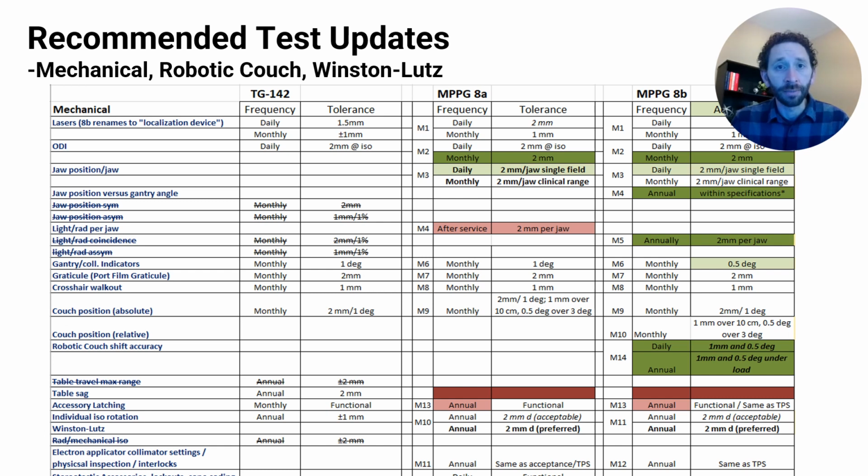Other things, light radiation, light rad testing, not necessary any longer as it was per 142. 8A put it as after service. 8B puts it as annually. So it's just a consideration of what's your light radiation, coming back to how are you setting up the patients, how are you setting up your QA equipment. It might make sense to include that as a particular criteria for these tests.